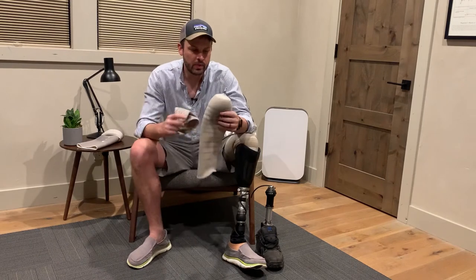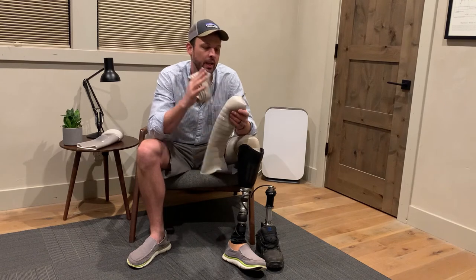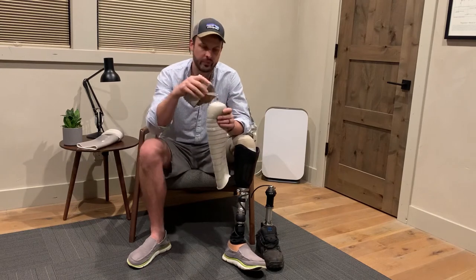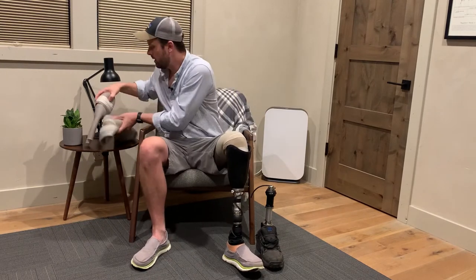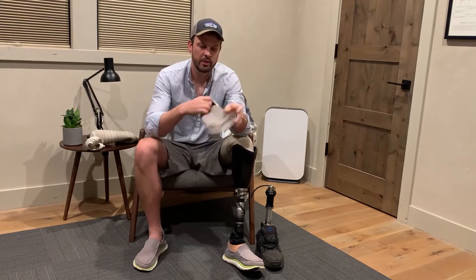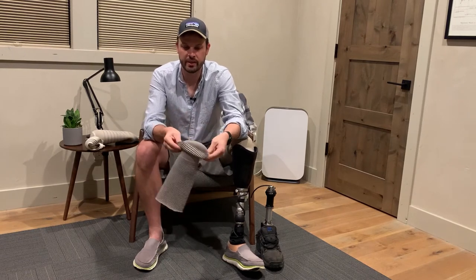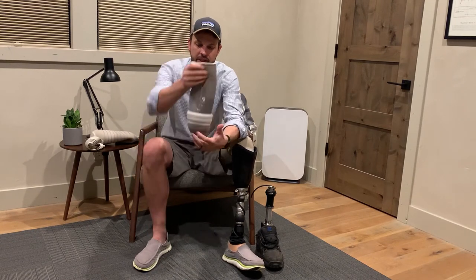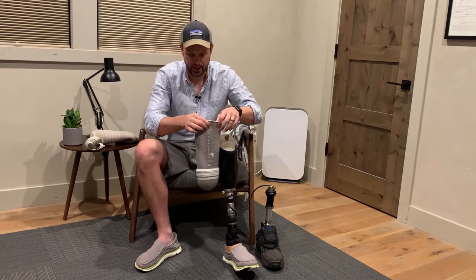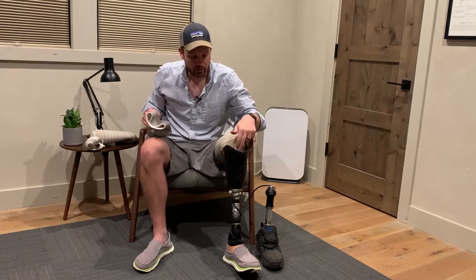Originally when I came home with my system, my prosthetist didn't have the parts in, and FedEx or somebody messed up the shipment so they didn't show up. So they sent me home with one of these — a vacuum system sleeve with fins — which gives you a seal down in your socket.